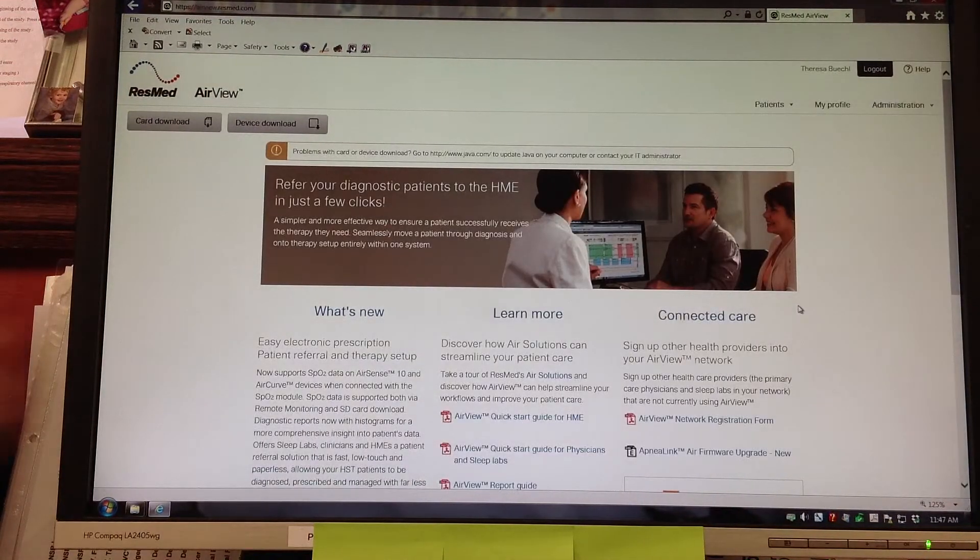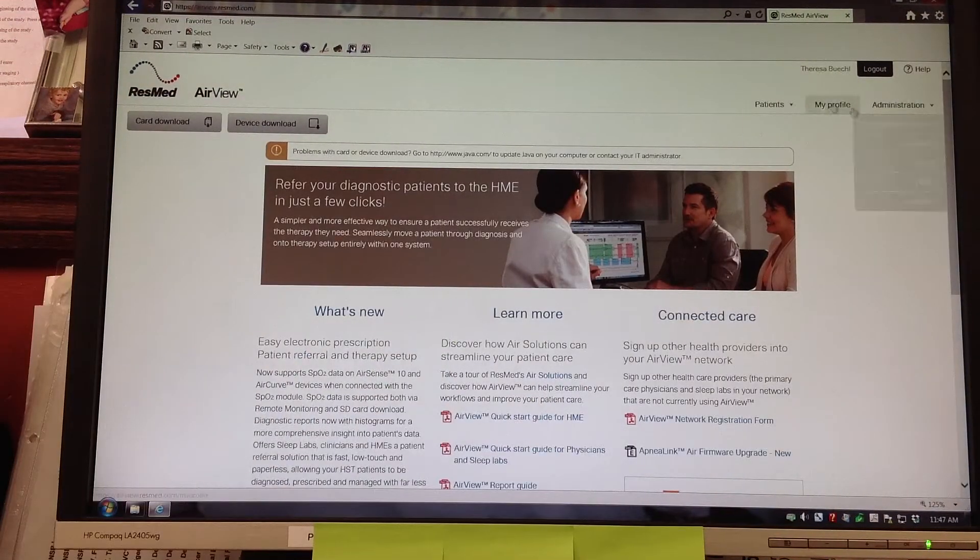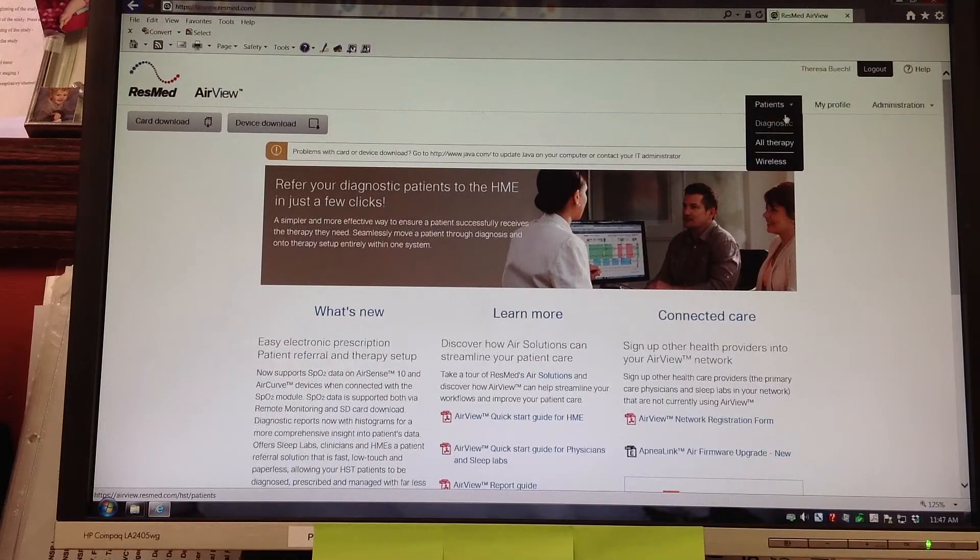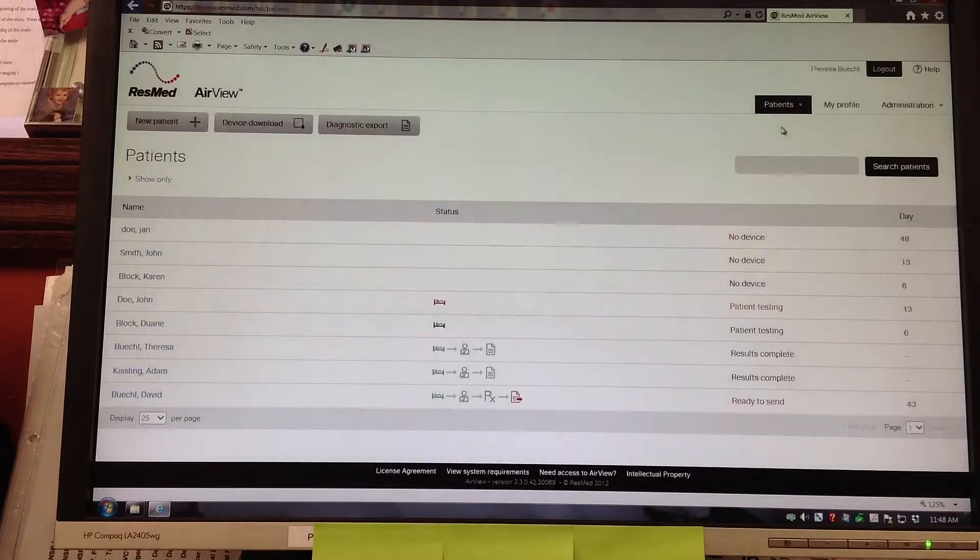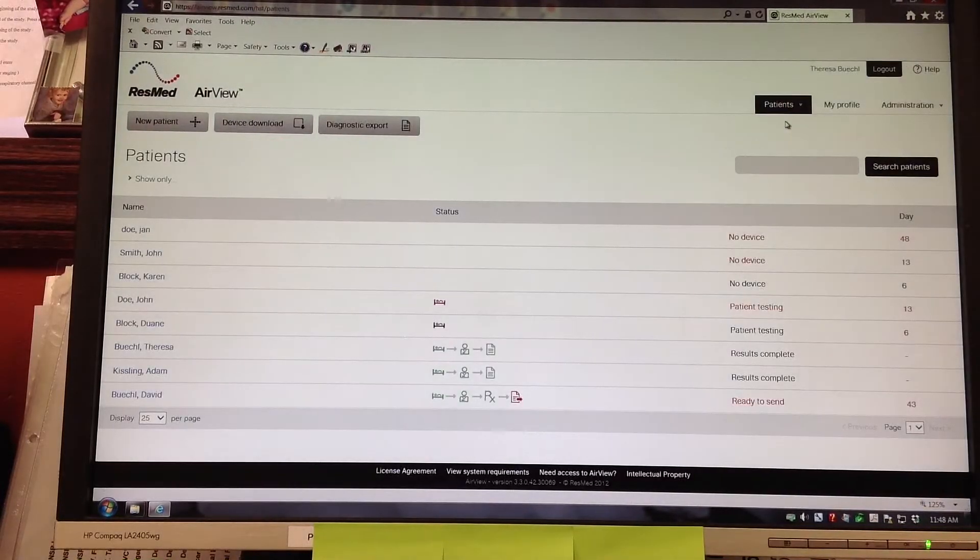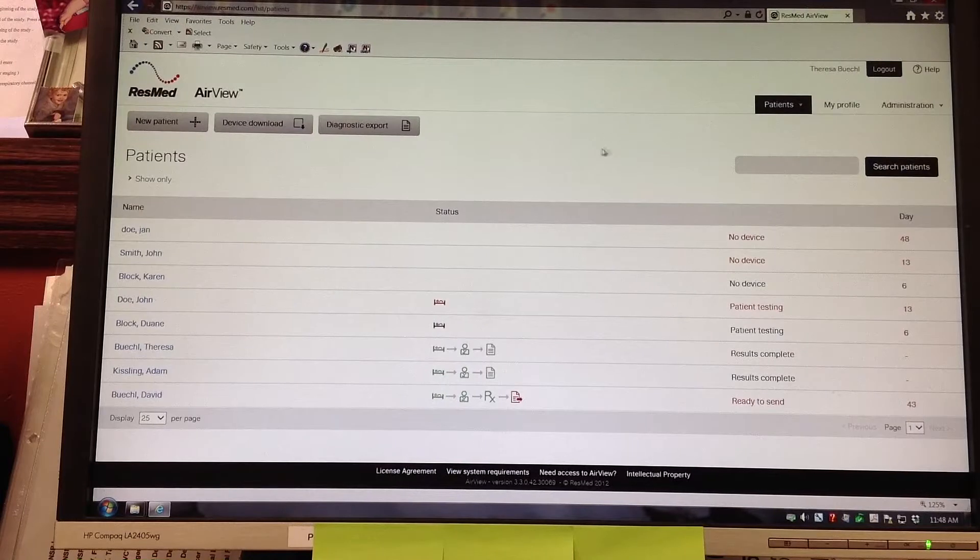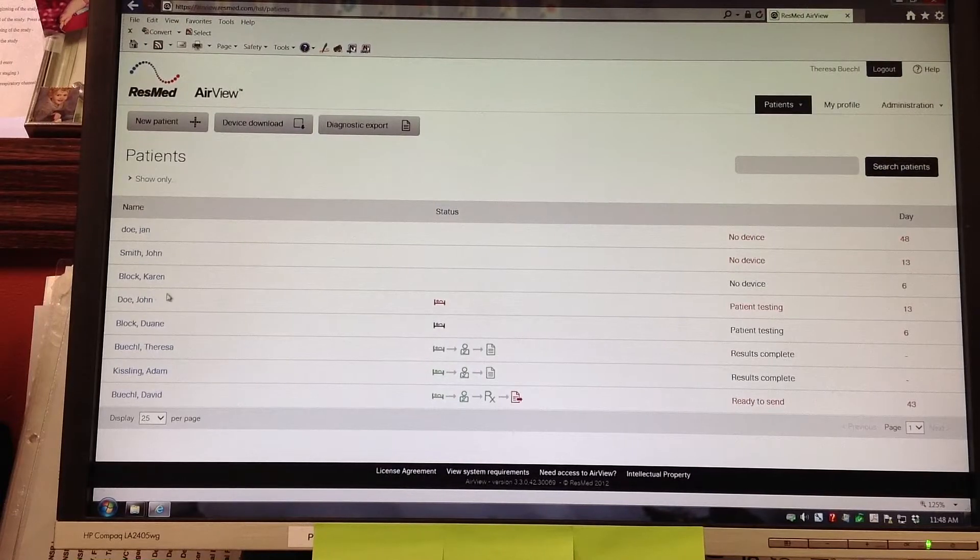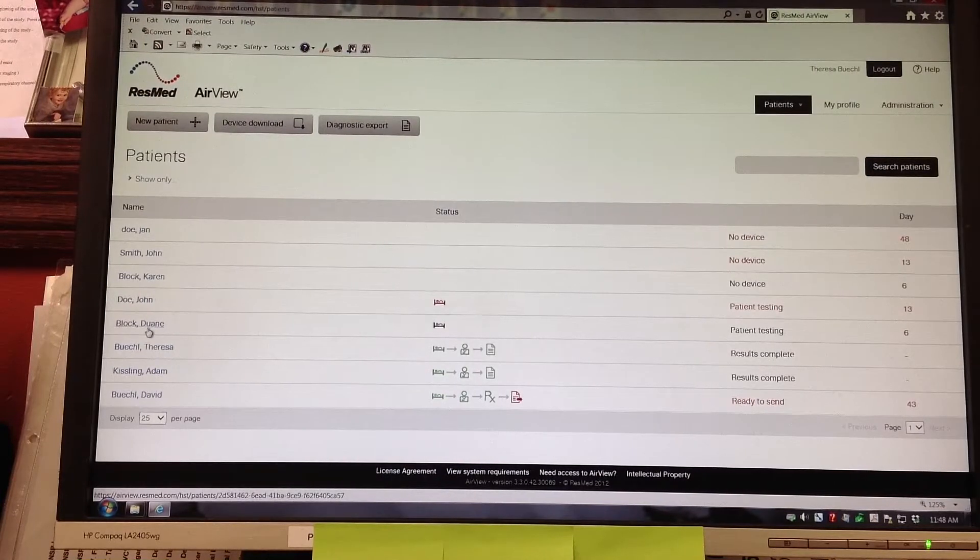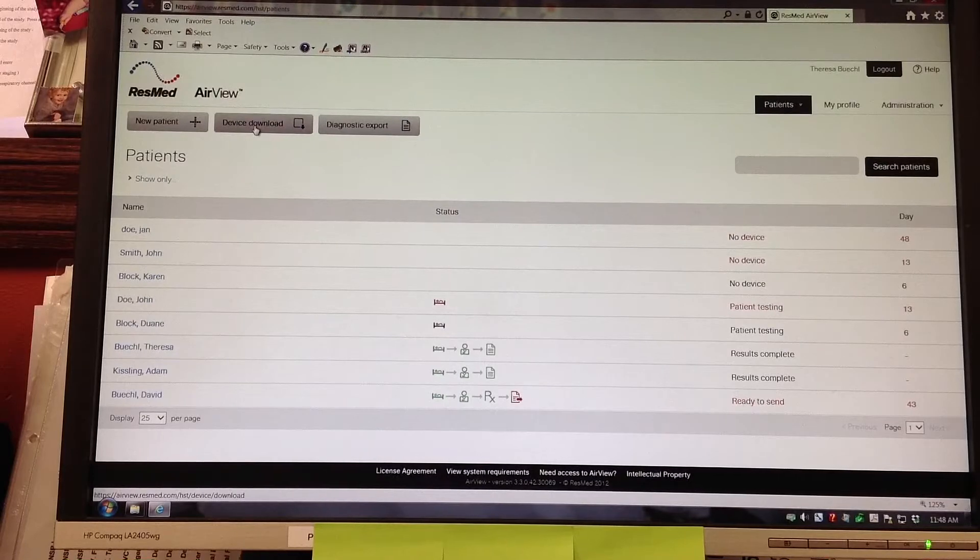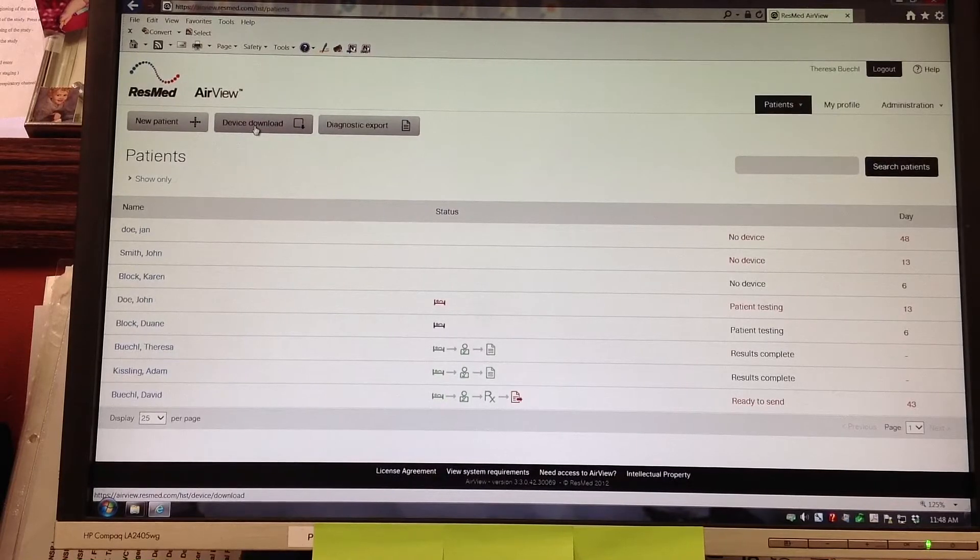She's going up to the patient drop down bar and clicking on diagnostic. Next she's going to scroll over to the left. There is a device download at the top. She is going to click on device download.